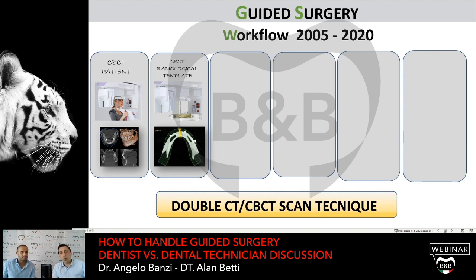No. If you want, you can use the real prosthesis of the patient. But the problem is that most of the time, the patient comes because he has a problem with that prosthesis. Yes, good. So the prosthesis has to be really performant, to feel good on the shape of the gingiva, and to fit in the right position in the mouth of the patient to be a valid prosthesis to be used in this system, in this technique.